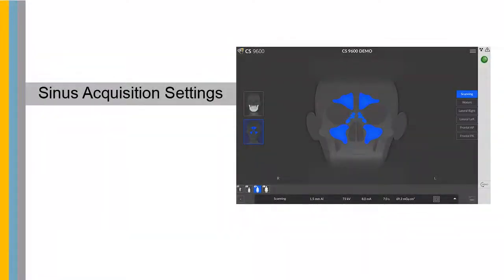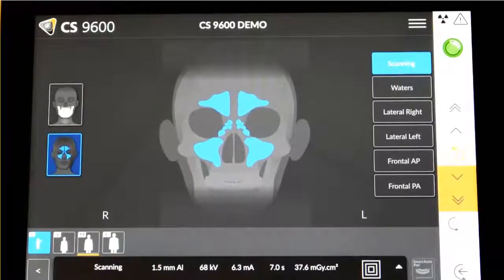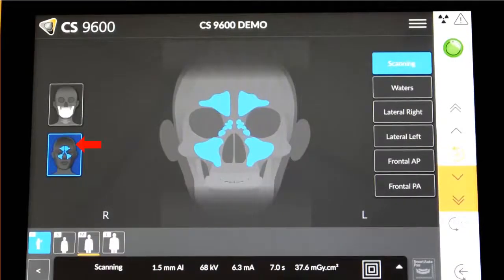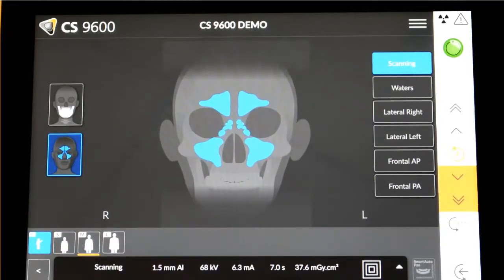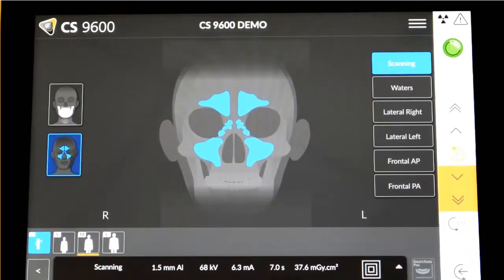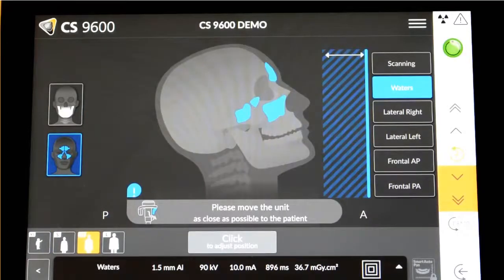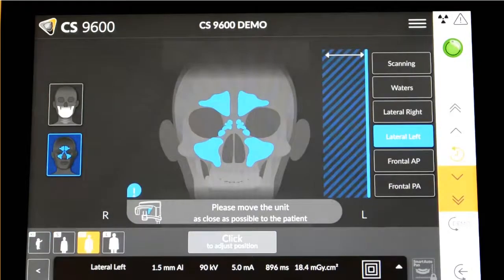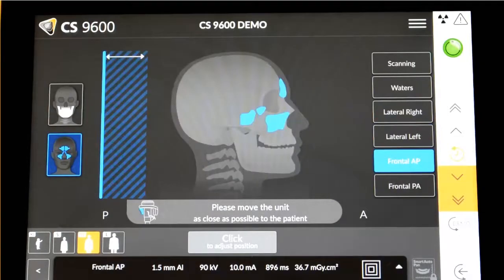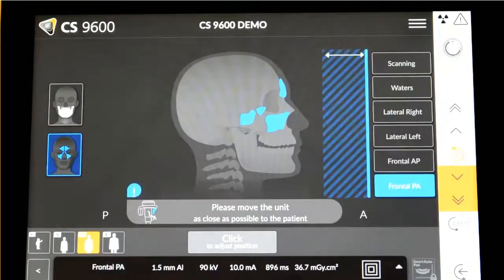To set the acquisition parameters for sinus images, follow these steps. In the acquisition interface, select Sinus Acquisition. Select the patient type and the radiological exam option: Scanning for a maxillary sinus exam, Water's exam, Lateral right or left, or Frontal AP or PA.